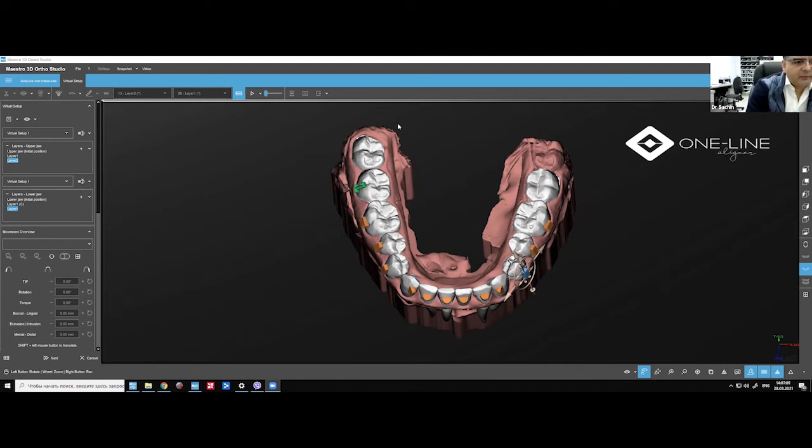Okay, Avrilev is asking, sorry I'm late, is the webinar being recorded? Yes. The measurements you have just mentioned are per aligner. Yes, the measurements which we have mentioned are per aligner. And I'll try to make a post of the general standards which I use per aligner, and maybe change it a little bit for different tooth shape and size of the roots and everything. Okay.